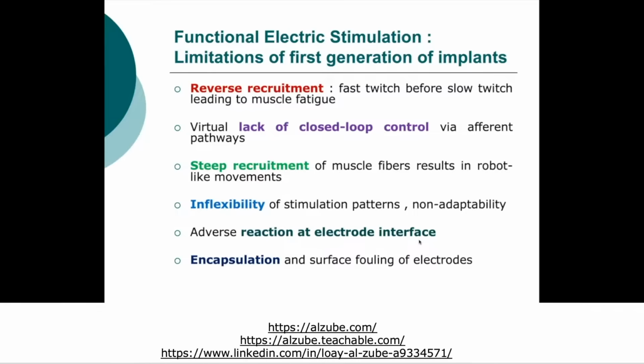Because I probably mentioned this last time in the lecture that if a material in the body is not compatible, the body will try to dissolve it. If it cannot be dissolved, it will be encapsulated by fibers, and this will eliminate actually the functionality of the electrode, because now it cannot measure the electrical activity. It just works as an insulation on the electrode.